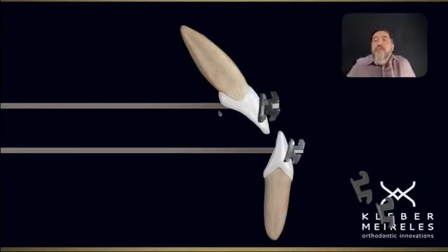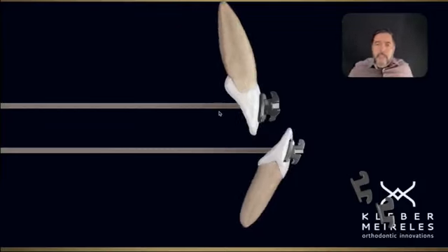Let's say what's going to happen when I apply this torque? The crowns, they are going to reach the inclination of the torque. Eventually, because we have a stiff arch wire, an elastic arch wire, that is changing the inclination of those anterior teeth. So this is what's going to happen. Of course, exaggerating a little bit here, but for you to understand the concept.